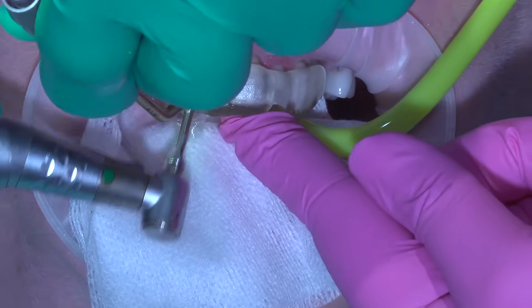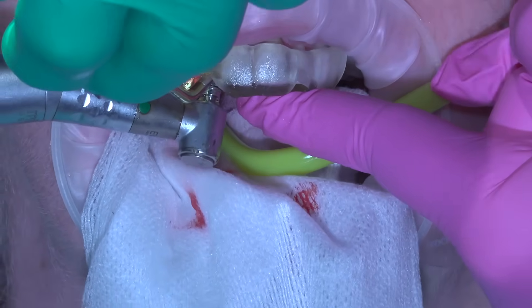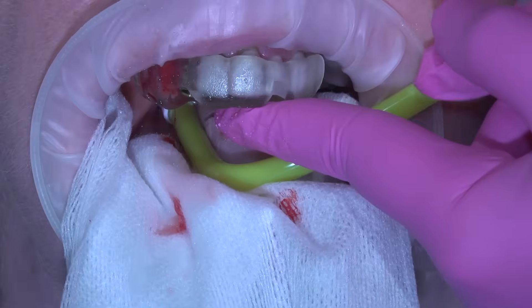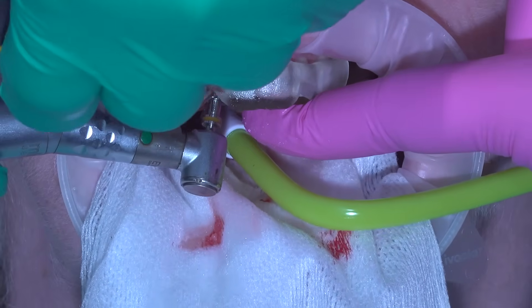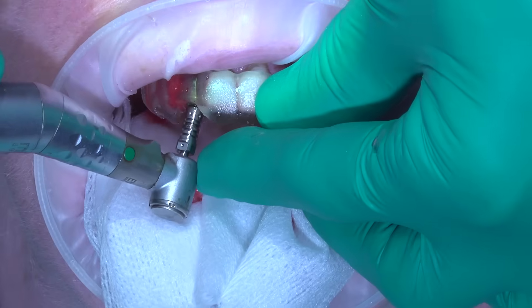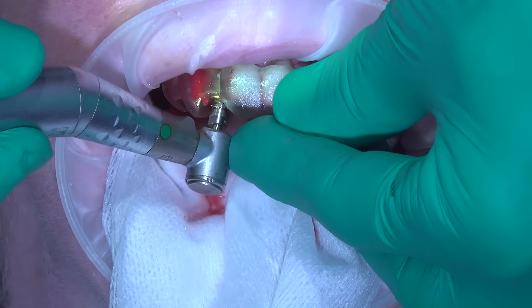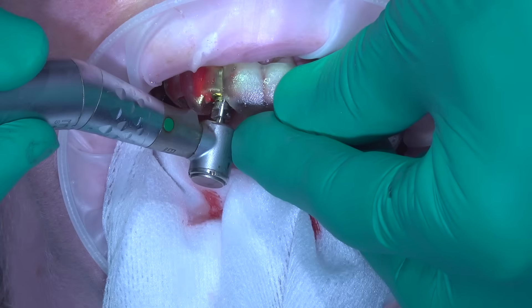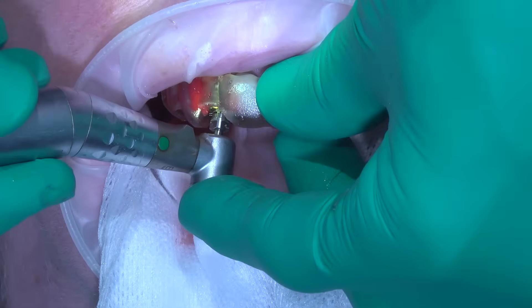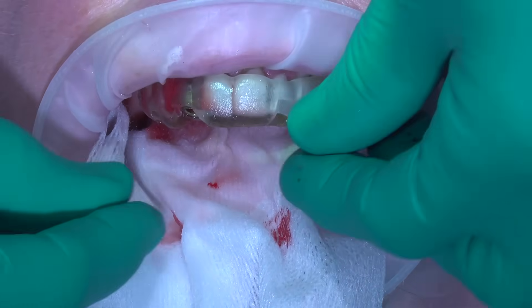Now we're using the BioHorizons Key system, and I've been using this for almost a decade — I've grown very comfortable with it. All the drills are the same length; we're just stepping through increasing diameter. Very fast drills. Pick up the implant, pick up the driver. There's no snap link on this driver, and I know where the depth stops are because I've been doing it for a while. I don't recommend that for new surgeons — go ahead and put the snap link on so you know your depth stop. Implant placed in just under three minutes.